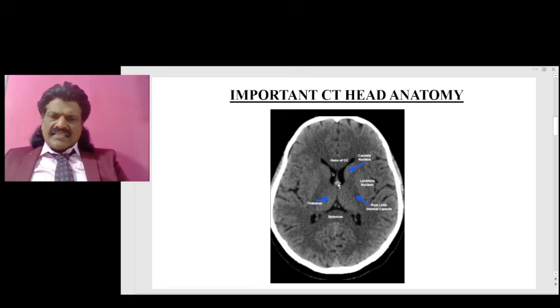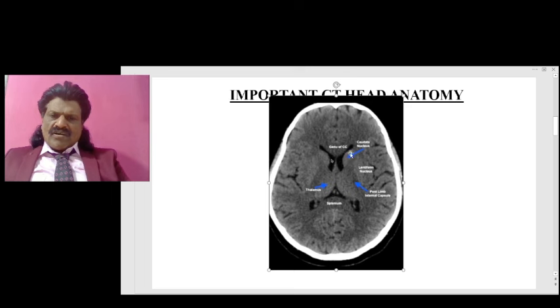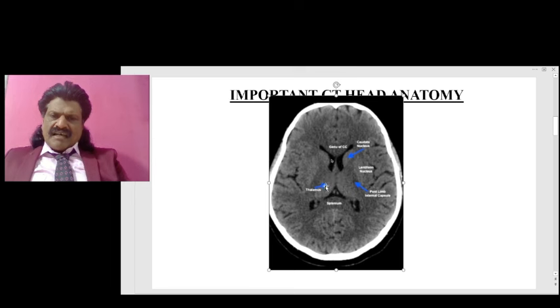Here you can see this is the third ventricle, and this is the occipital horn of the lateral ventricle. Just adjacent to the frontal horns of the lateral ventricle is the caudate nucleus — a very important landmark. This is the genu of the corpus callosum and this is the splenium of the corpus callosum. Just adjacent to the third ventricle is the thalamus.